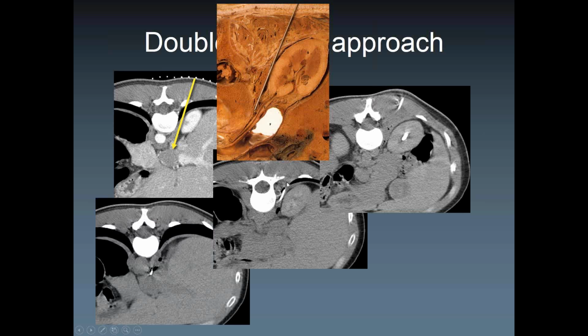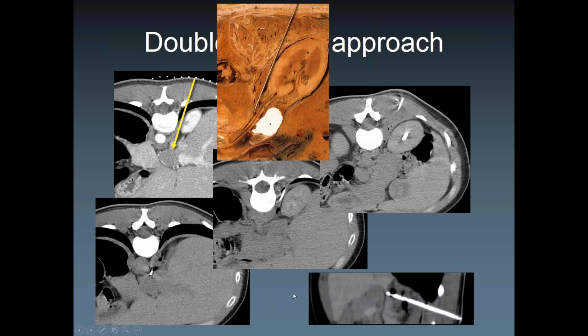And here you're already beyond the critical zone. The critical zone for these ones is usually to not go through pleura, because you would again open a different compartment, right? You don't want to cause cell seeding to the pleural space for a retroperitoneal or peritoneal lesion, obviously. And this one worked out okay. You can inject a little bit of gas sometimes to increase the space around that, but sometimes the gas is unintentional, but it's also usually not harmful.